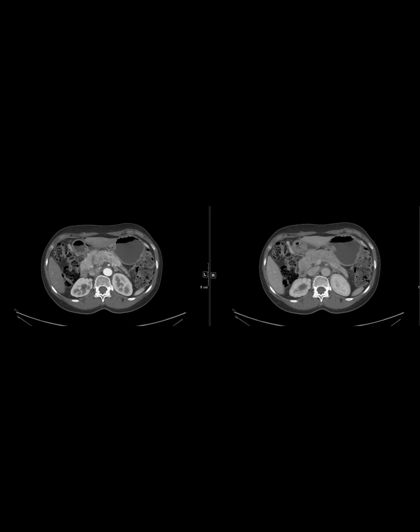With caution, yes. When we were releasing version 2018, we tried to create some sort of guidance on the time difference between the two exams that you can use. There's just no good data. We were thinking within 3 months is okay, but that's purely based on what we think is okay. So the answer is there's no data on it, but provisionally you can do that and say, arterial phase hyperenhancement was demonstrated on X study.